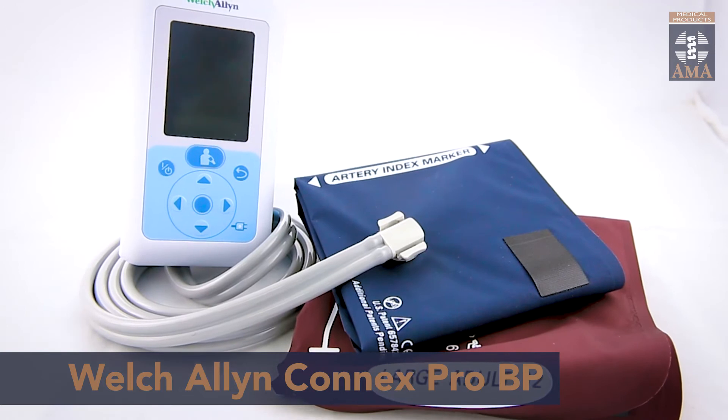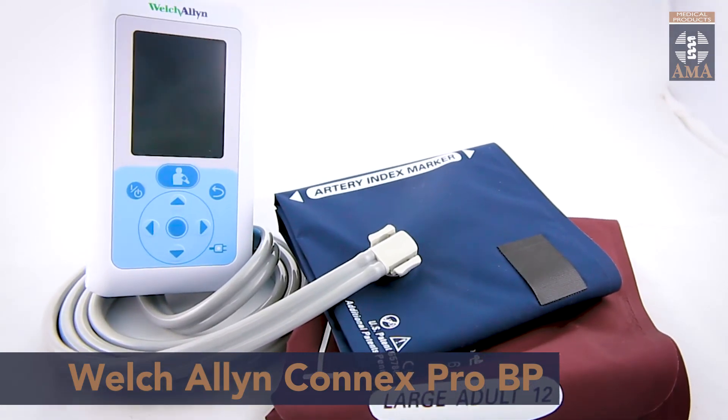You can take a hundred readings with just one charge of its lithium-ion battery and recharging of the device is rapid. It is compatible with an extensive range of Welch Allyn and FlexiPort cuffs, so why don't you click below to read more and grab yourself one today.